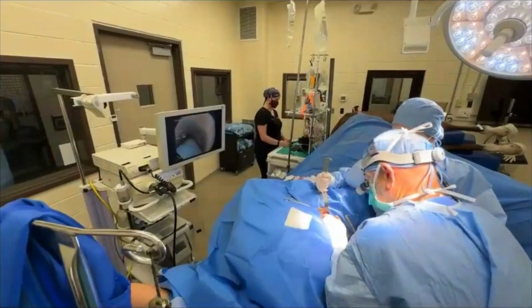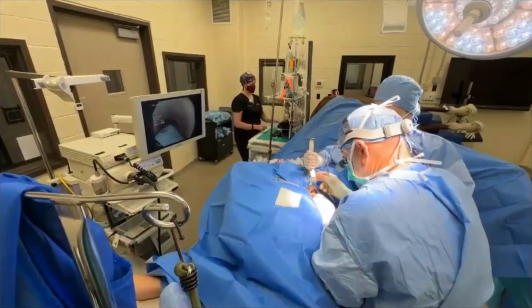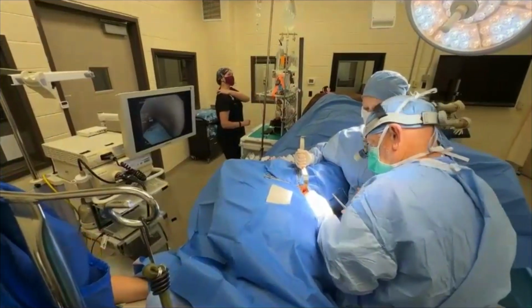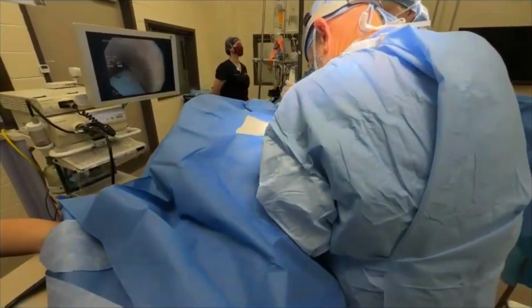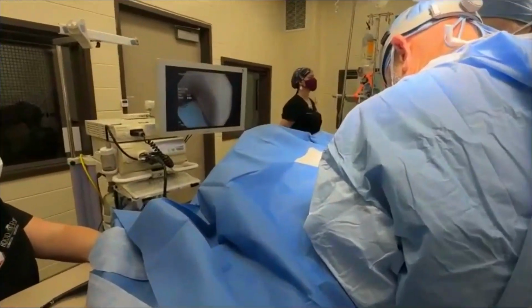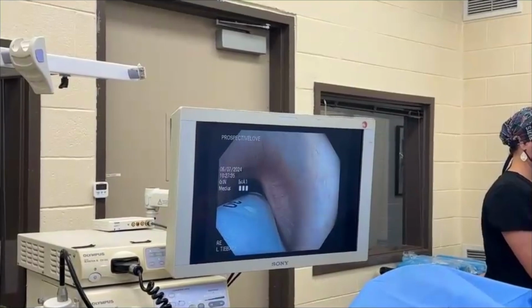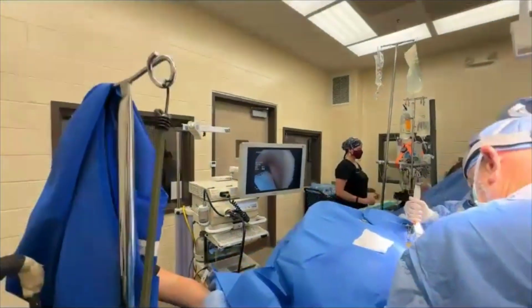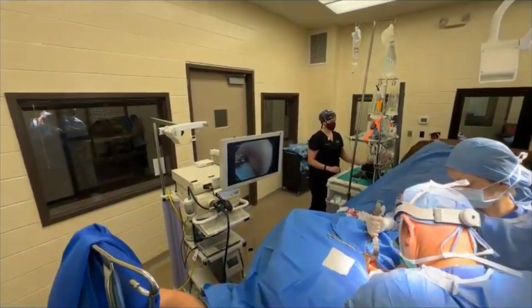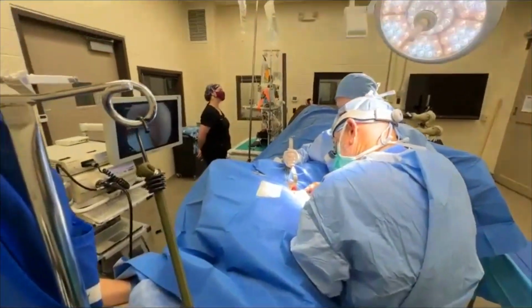Okay. And so what we're seeing here is the incision area that you're working in. Correct. We're not in the airway doing this. We avoid going into the airways. We don't want any contamination of that site. So we can see on the screen that the airway is not being disrupted at all. Exactly. You can see the endotracheal tube in there, but you don't see any sutures going into that.